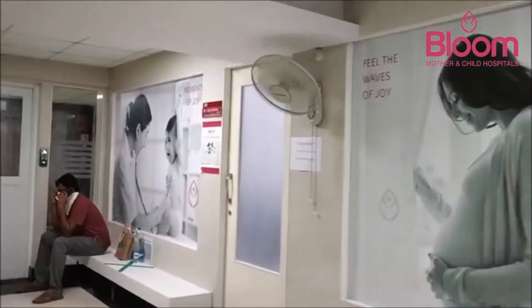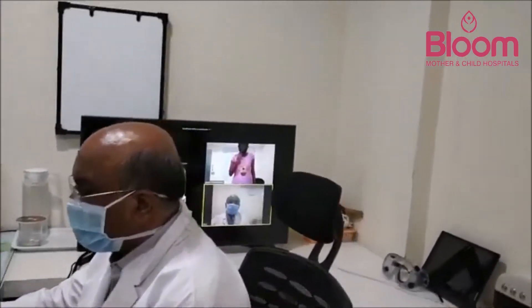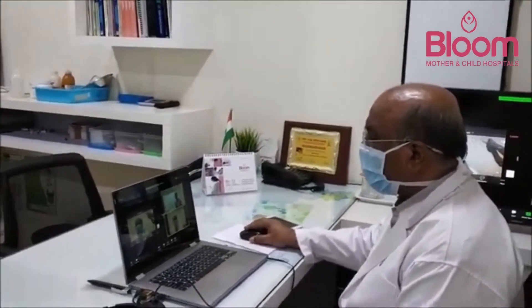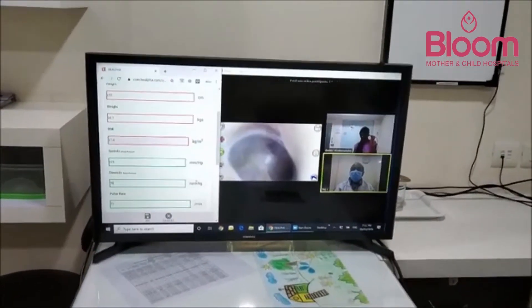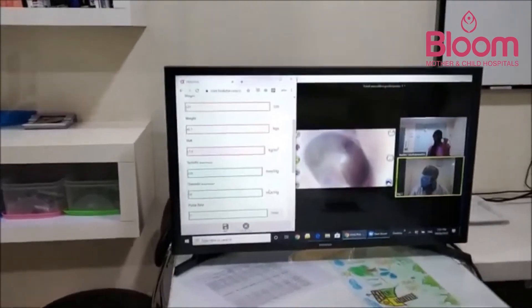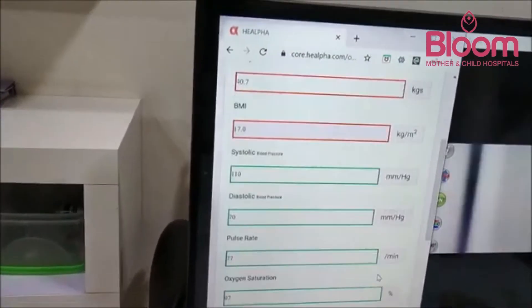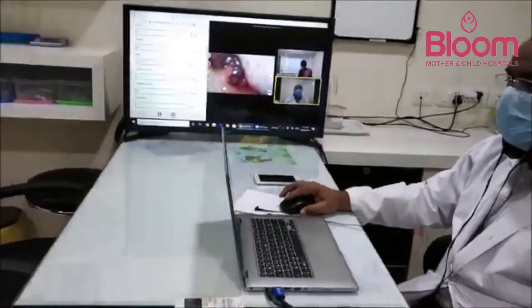We now move into the doctor's chamber to see the other side of the consultation. The doctor was equipped to view Kavita's images and all patient readings were transmitted here in real time. This is how the doctor reviews the data on a TV screen and prepares a digital prescription for the patient.